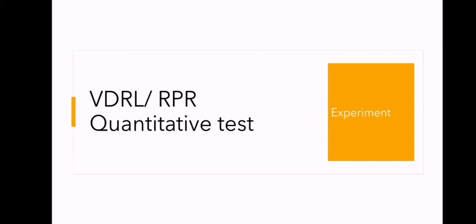Now let us begin the VDRL-RPR quantitative test that was actually performed and recorded in our microbiology lab. The quantitative test is performed to assess the quantity of antibodies present in a given serum sample at various dilutions. Presence of antibodies at higher dilutions indicates a high amount of antibodies formed; when limited to only the first few dilutions, the antibody amount is low.